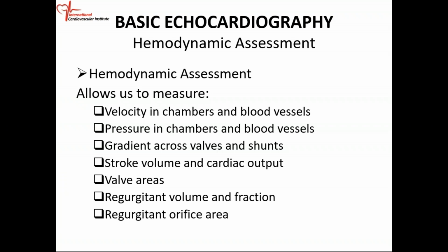Regurgitation: when we assess the severity of regurgitation, looking at regurgitant volume and regurgitant fraction, we use our hemodynamic principles as well, and then regurgitant orifice.